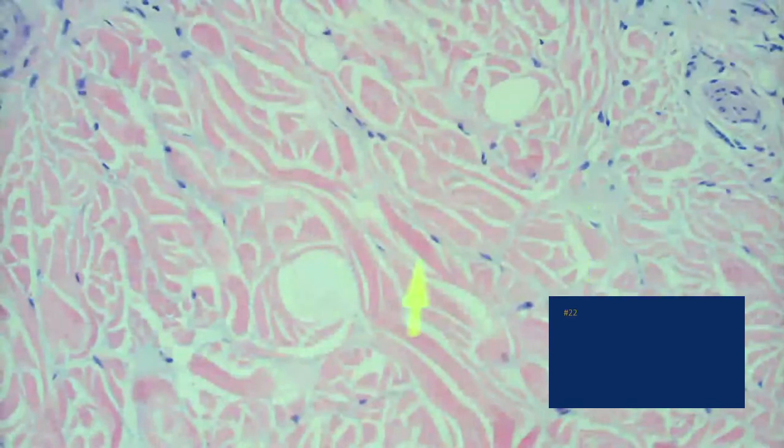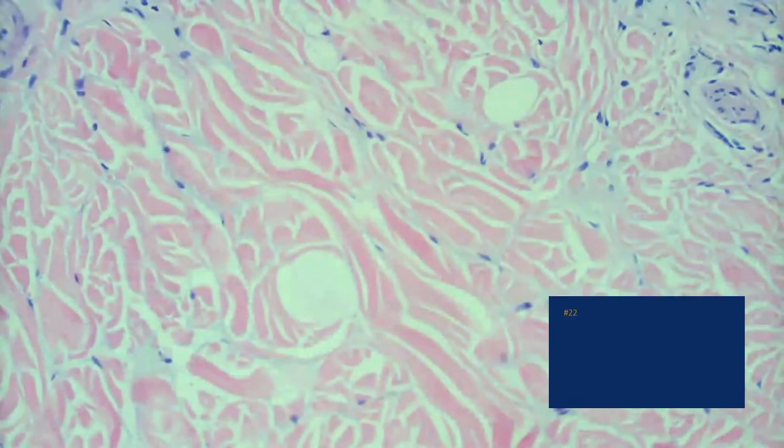What's this stuff? Mucin. Yeah, mucin. So if you see mucin in the dermis, in this case it's such a nice example. You've got a lot of ancillary features: the interface change, the basement membrane zone, the follicular plugging. So in this case, you really wouldn't confuse it with anything.